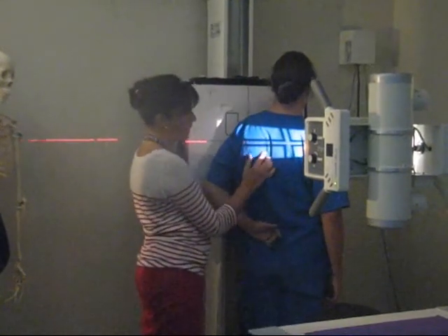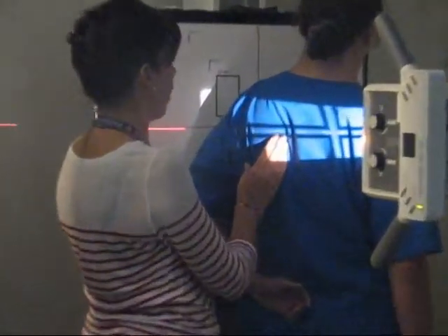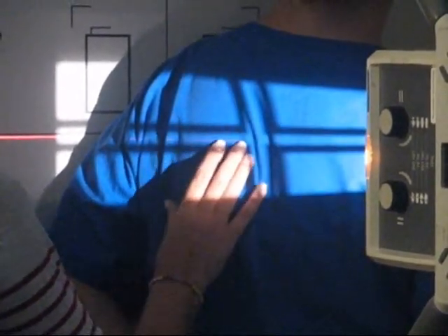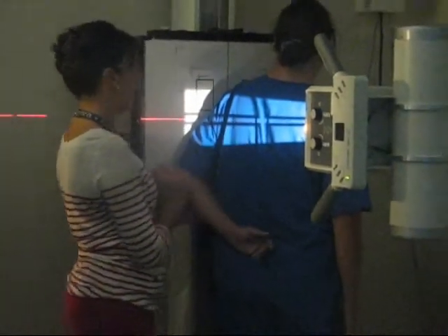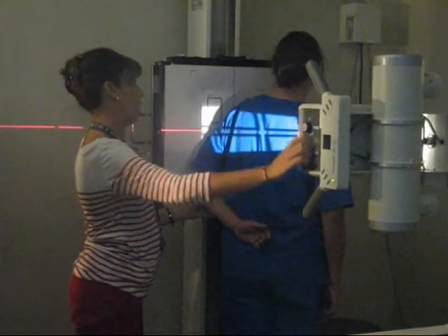And as you can tell, that kind of juts out the scapula, okay? So that's what you're going to do. You're going to position your patient to where the CR is going to come in right where the scapula juts out, where you can feel the scapula jutting out, okay? Make sure that you get everything.